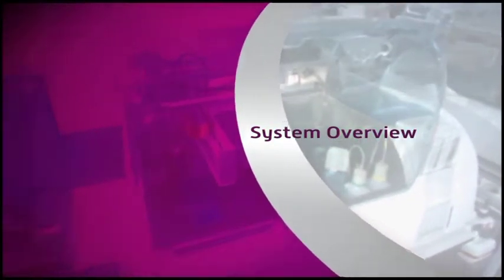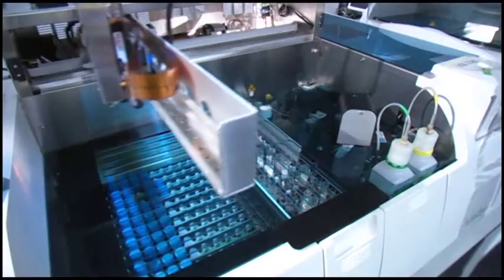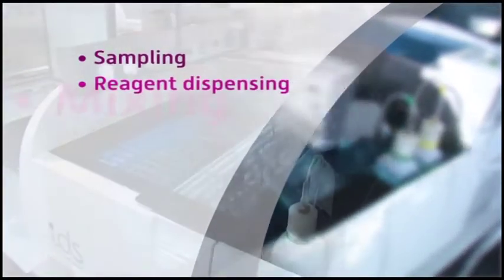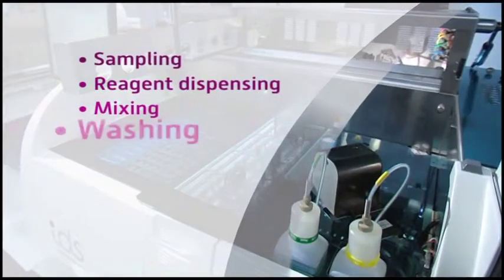The IDS Isis is a modular based system with modules to perform sampling, reagent dispensing, mixing, washing, onboard dilutions, temperature controlled incubation, reading, and data reduction.